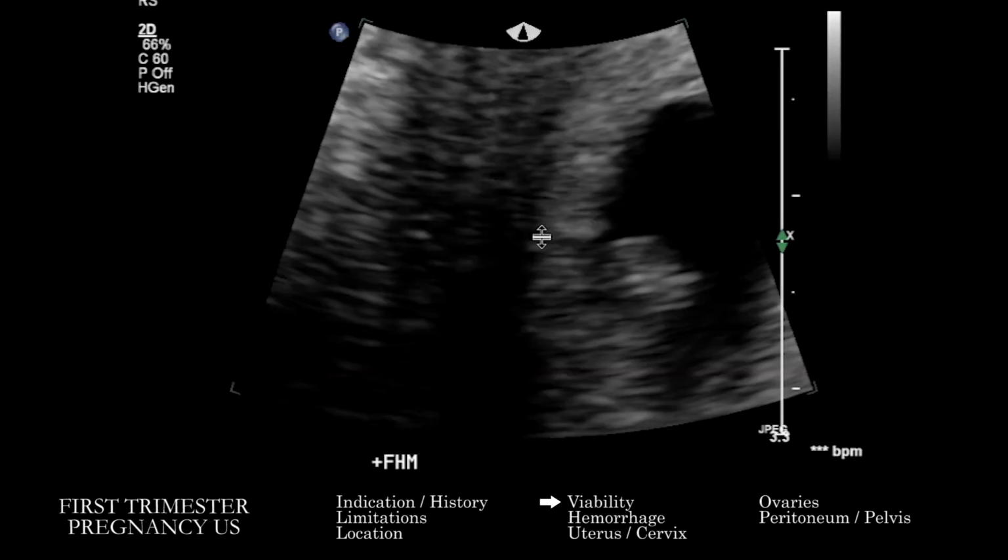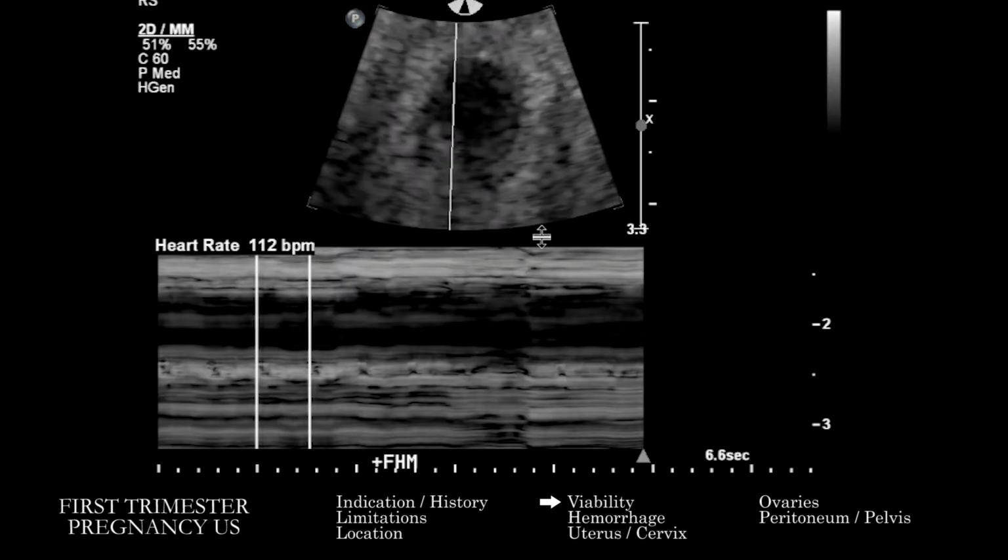Once we get to the end of this, what you want to do is get to an image where we have M mode performed, to get a sense of what the actual fetal heart rate is. It's important when looking at that fetal heart rate to make sure that we are capturing the actual movement within an area expected to be fetal heart, and not capturing maternal heart rate, and making sure there's a correlation between that and activity that we are seeing on cines.